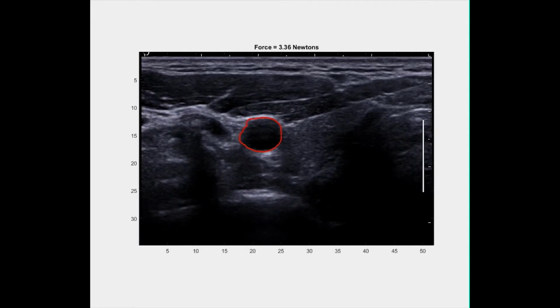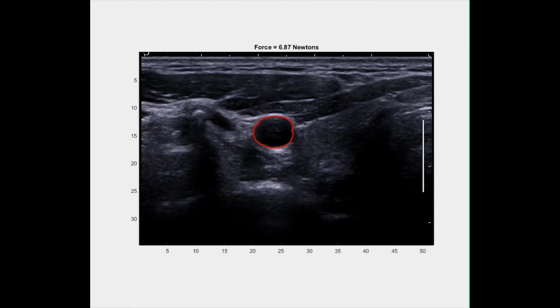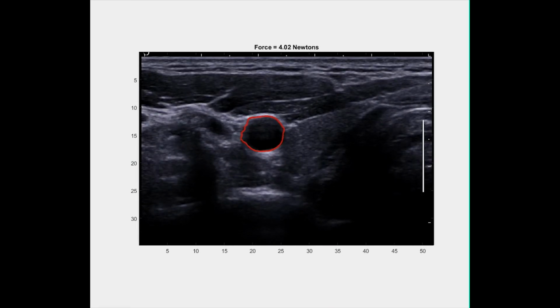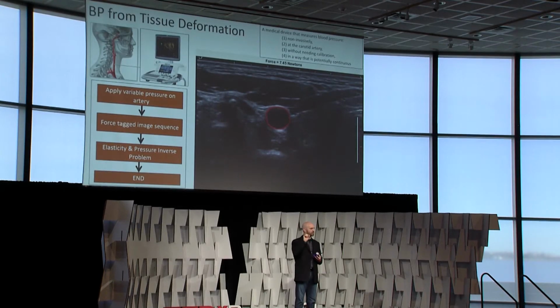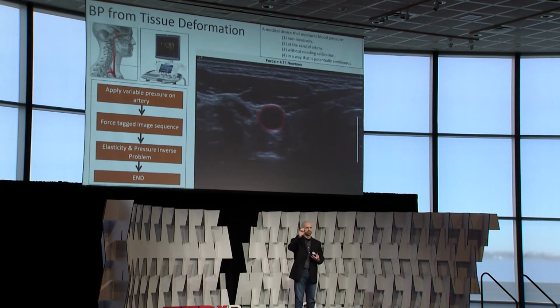So what we're looking at in this video sequence is an application of an ultrasound probe slightly resting on the carotid artery, where the patient or a caregiver is just modulating the amount of external pressure that's being applied. You can see that in the video by the distance between the surface of the skin and, say, the musculature to the left of the artery getting smaller and smaller. So we're steadily increasing the amount of pressure that's applied from the outside of the body. At the same time, you're seeing the pulsating of the artery from the inside of the body, this pulsation of the blood pressure pumping through the carotid artery.